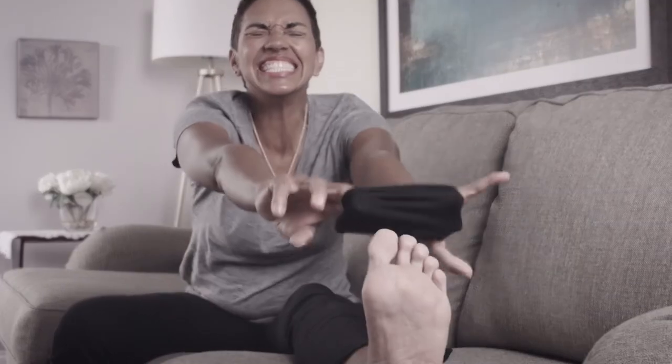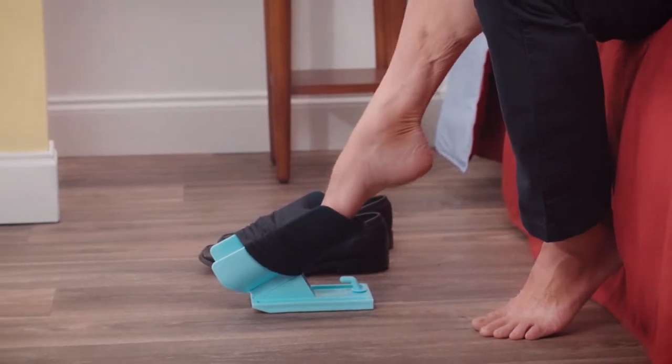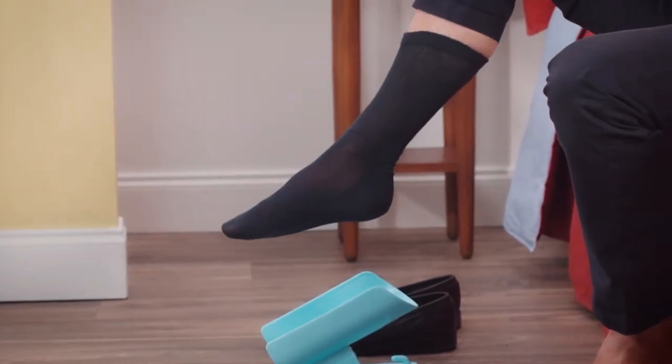You struggle and strain. You're so far away. Well, not anymore. Introducing the Sock Slider — the pain-free, no-bend-over way to comfortably put on your socks every day.